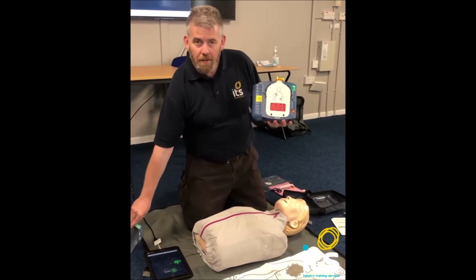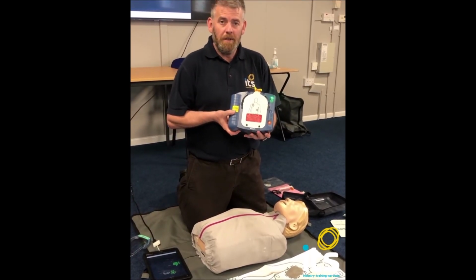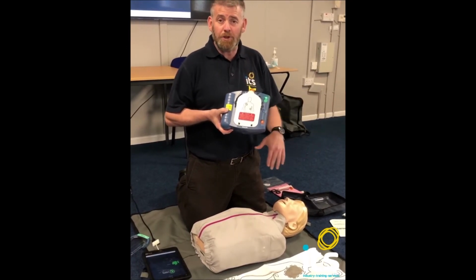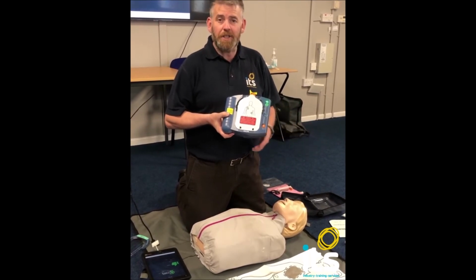Begin by removing all clothing from the patient's chest. Cut clothing if needed. So, items that require cutting, t-shirts, you need to remove lots of clothing here, and you need to get the person down to skin. So, especially when you're dealing with females, bras need to come off as well.